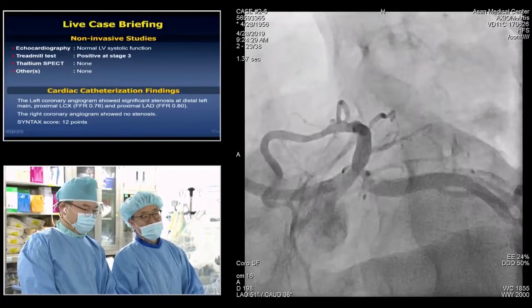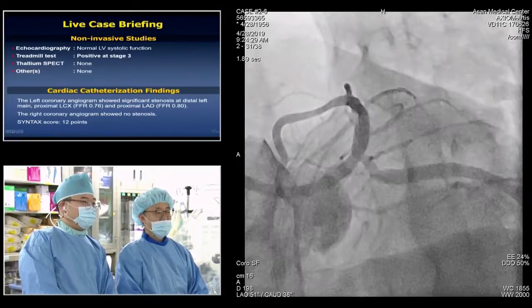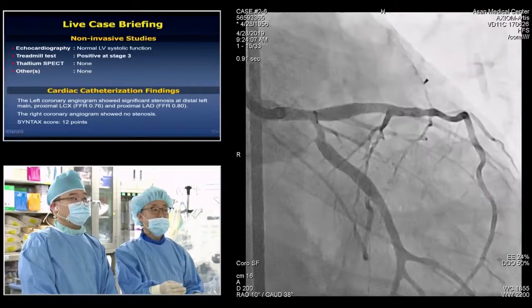Greg, I'd just like to point out, you look at the left main and it may not look that severe, but if you look at the size of the left main compared to the proximal LAD and circumflex, it's diffusely diseased. Yeah, it's a great point, Gary. That's why it's so important to evaluate these with intravascular ultrasound. We already checked the intravascular ultrasound, so before intervention, we're going to show our baseline IVUS.